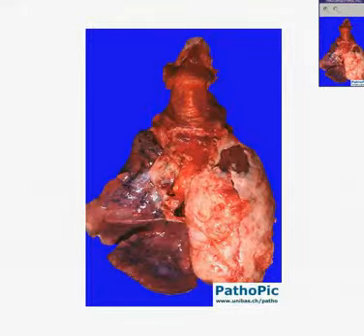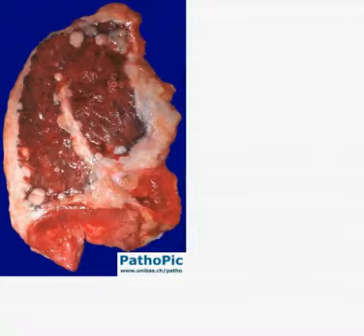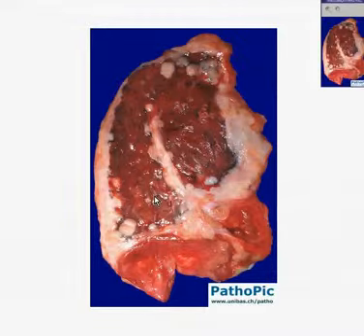Or perhaps could it be a tumor that started around the lung, like along the mesothelial or pleural surface, and is now compressing the lung, like you see here? This is a classical mesothelioma. I guess you could call mesotheliomas lung tumors, but remember, they originate not from the lung parenchyma itself, but from the surrounding mesothelial cells of the visceral or parietal pleura. And this is a diagnostic appearance.